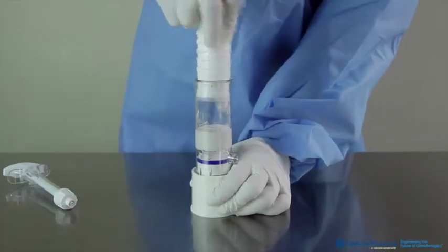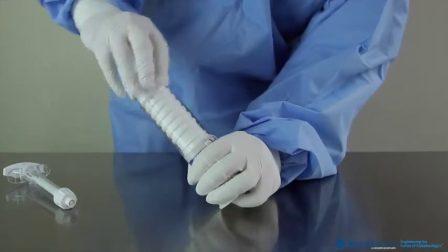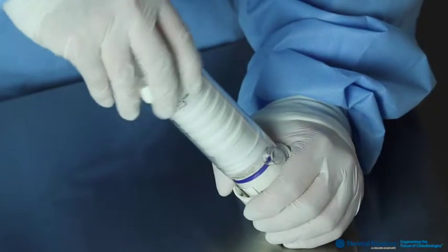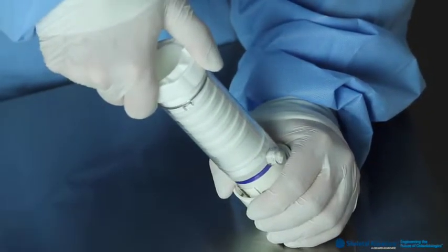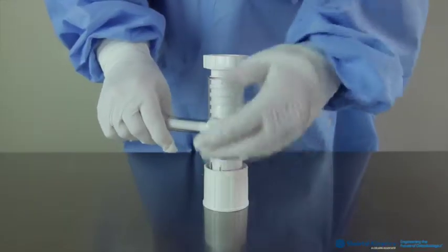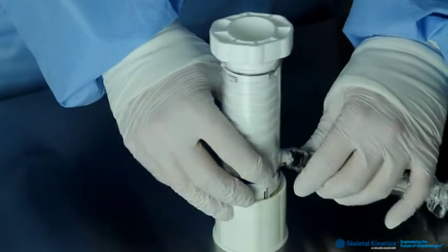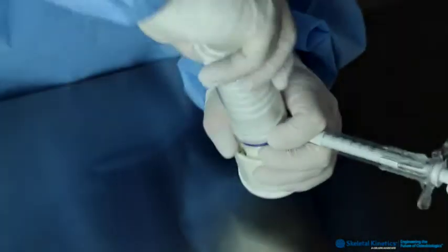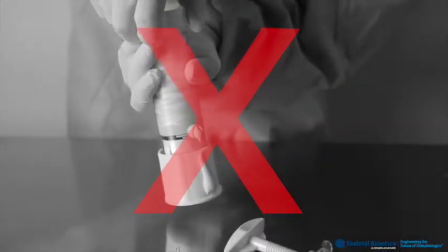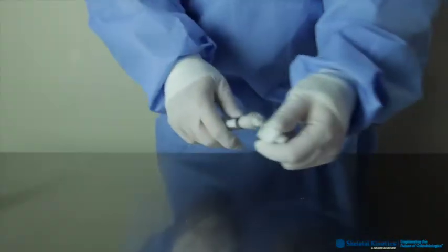Now insert the plunger into the mixing chamber at a slight angle. Push until it stops. Then rotate the plunger down until SKaffold Flow starts to extrude slightly out of the syringe port. Remember to remove the syringe cap before affixing the syringe on the port. Then continue rotating plunger until syringe is filled. A tip, it is best to do this quickly. It will help ensure more material is pushed into the syringe. Remove syringe from port and reattach cap.